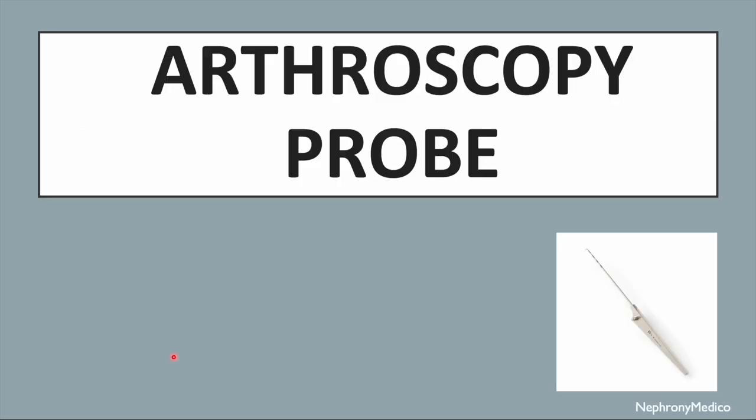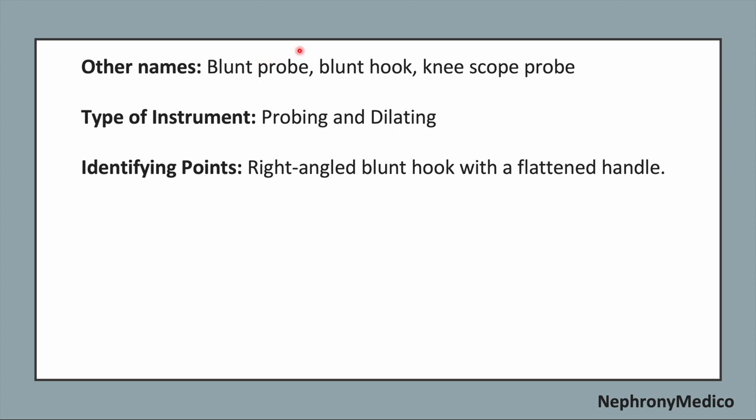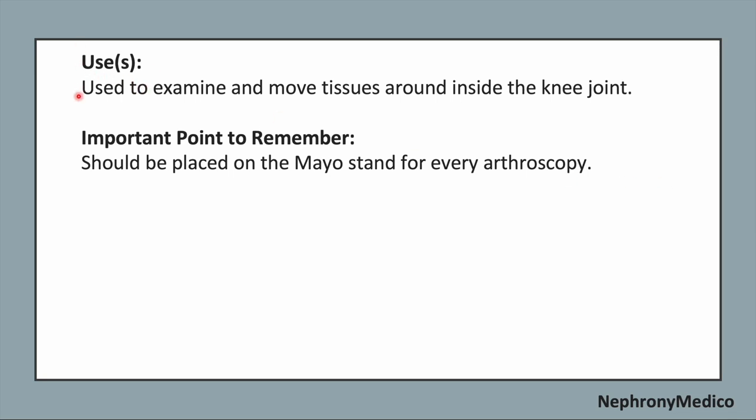Let's talk about arthroscopy probe. This is a picture showing arthroscopy probe. The other names of this instrument are blunt probe, blunt hook, or knee scope probe. It is a probing and dilating type of instrument. Now, identifying points of this instrument. It is a right angled blunt hook with a flattened handle. Use. It is used to examine and move tissues around and inside the knee joint. Important point to remember while using this instrument. It should be placed on the Mayo stand for every arthroscopy.